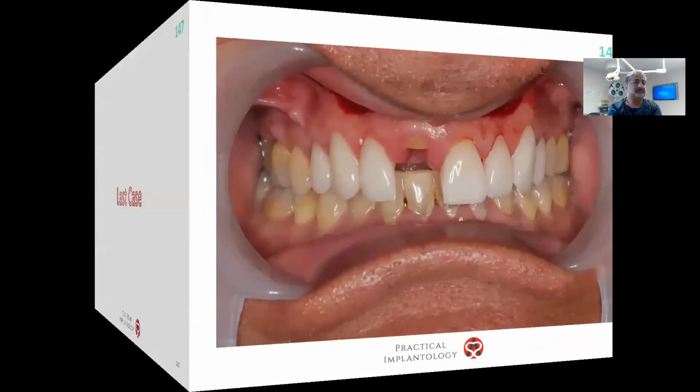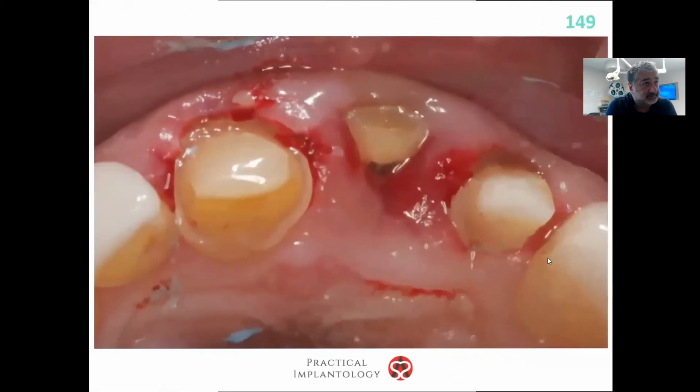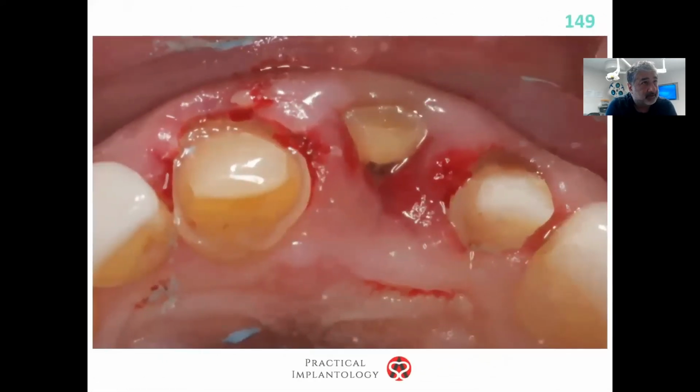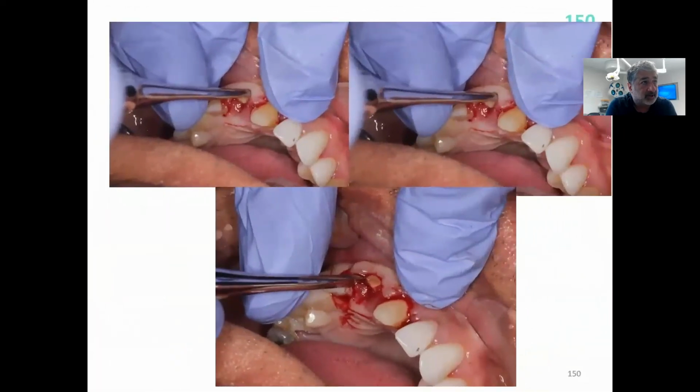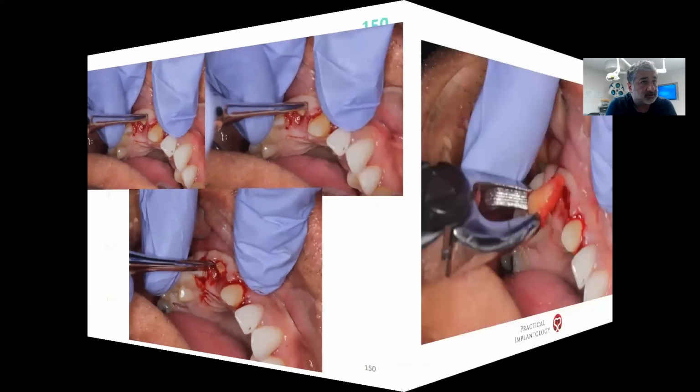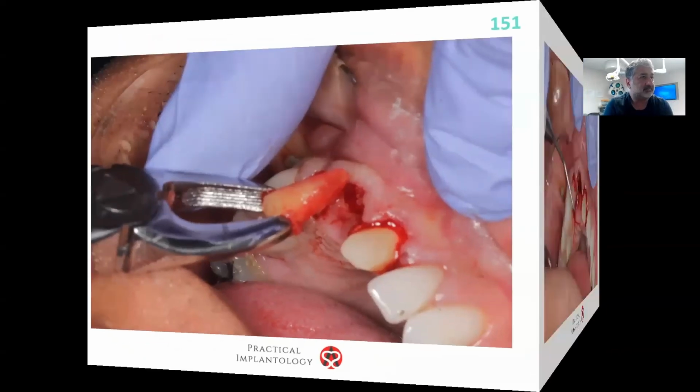Last case. Patient came, sadly fell outside the surgery on a paving stone. Not that I lifted that paving stone on purpose. The tooth had to come out. Again, I will just go down the long axis, twist and wait. There'll be cytokine release, and there'll also be deformation of the socket. Wait.